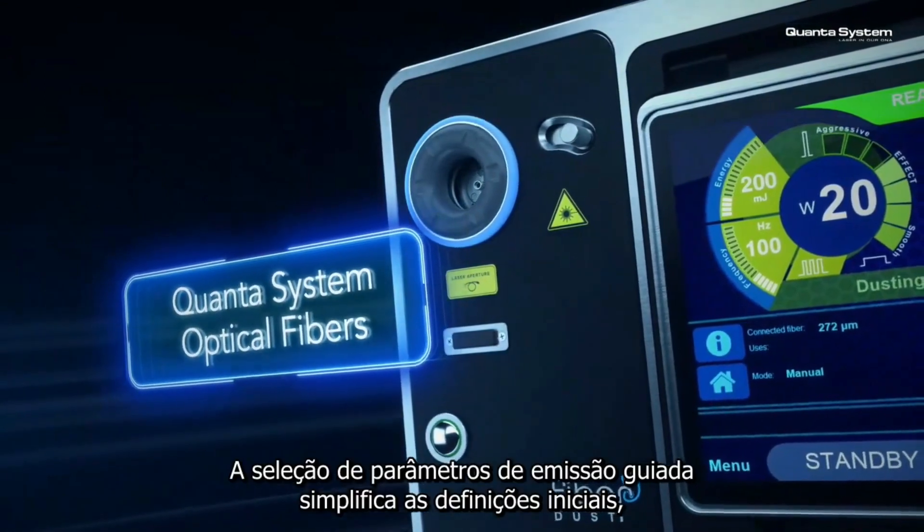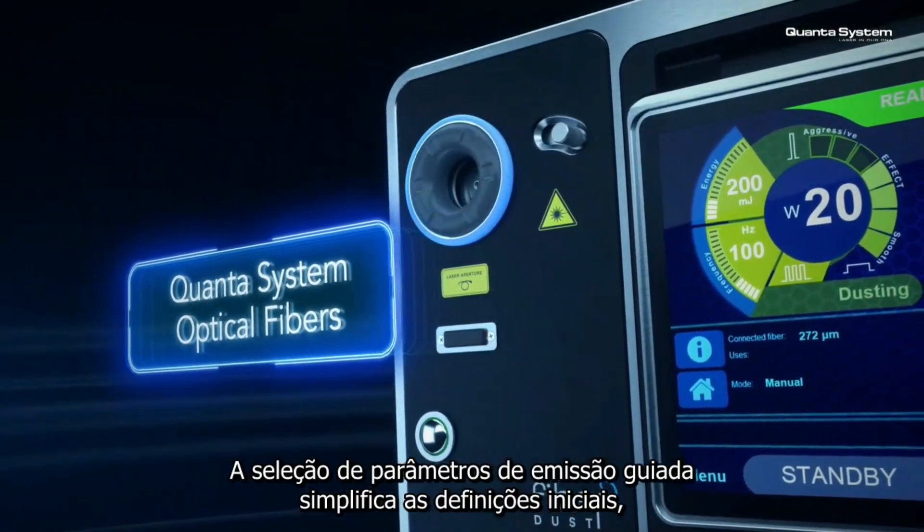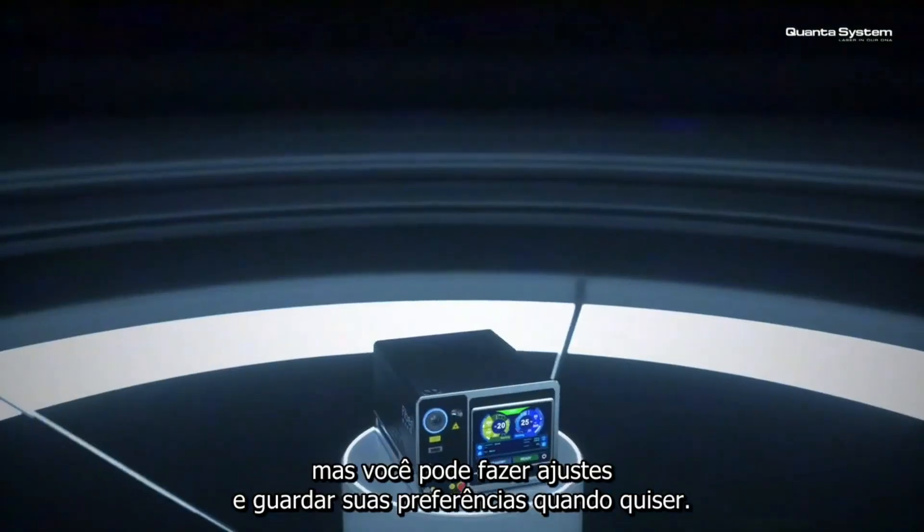The guided selection of emission parameters simplifies your starting settings, but you can make adjustments and save your preferences anytime.